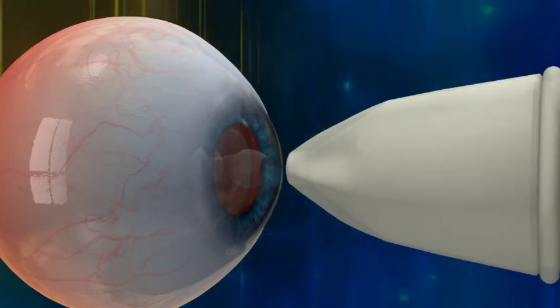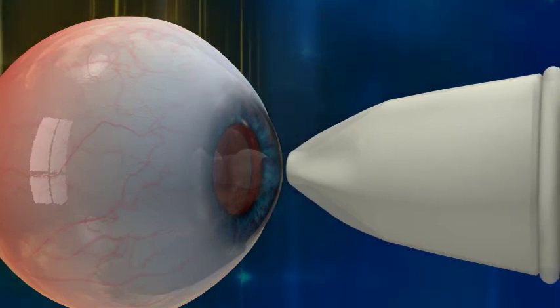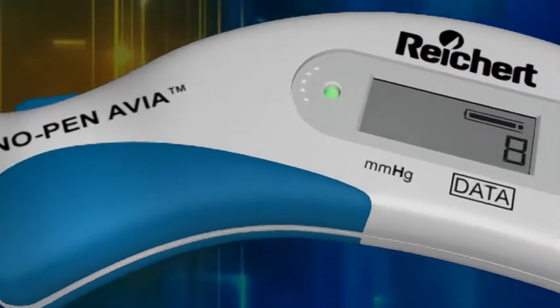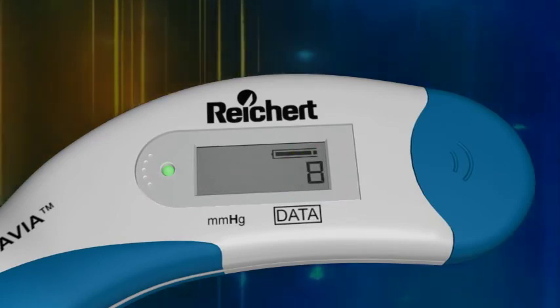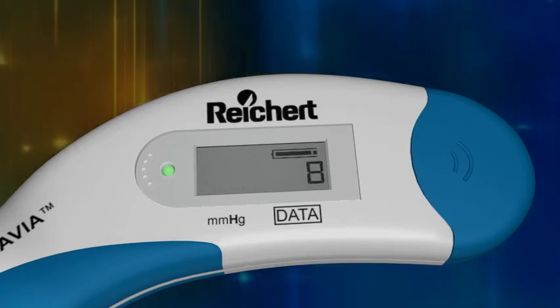With ideal technique, you will hear two clicks for each touch of the eye, signaling that a reading was taken on both the inward applanation and outward applanation. The data field of the LCD registers the number of readings obtained. The Tonopena Via tonometer takes 10 readings and displays the average.